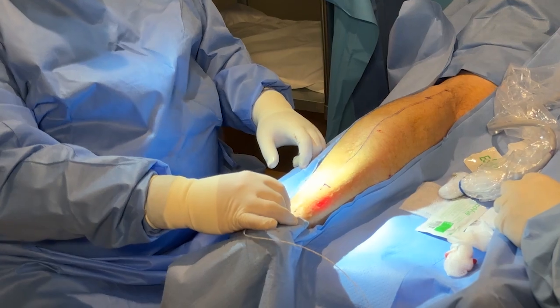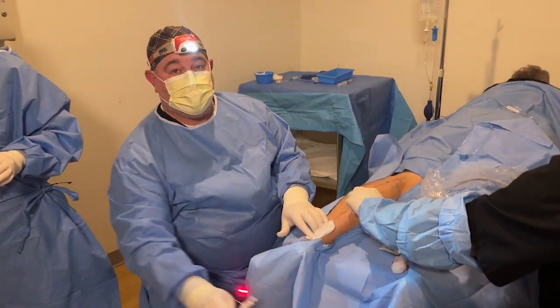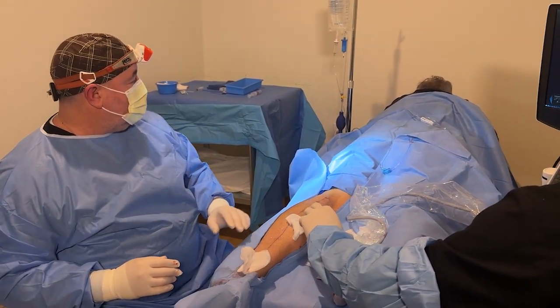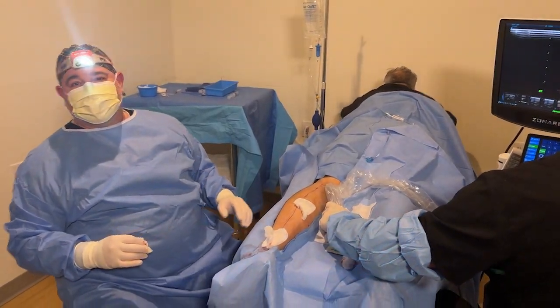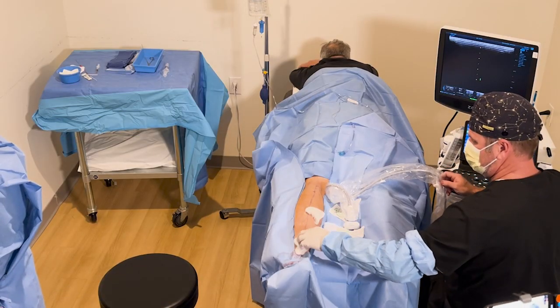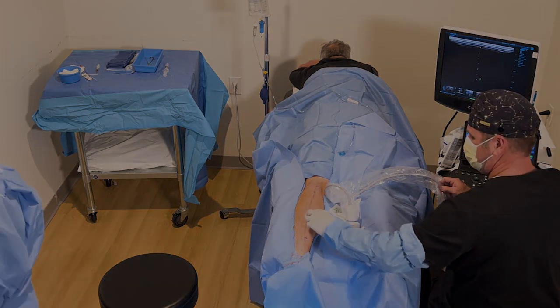And then down to the end here — and that's it. We have ablated the left small saphenous vein. Patient did well. 'Any problems, Jeff?' 'I'm just waking up.' 'There you go. All right, thank you.'